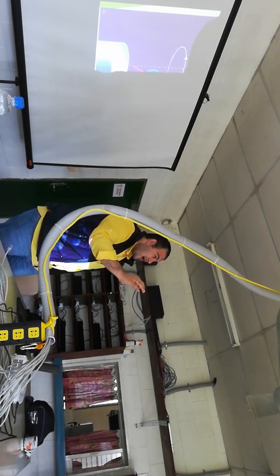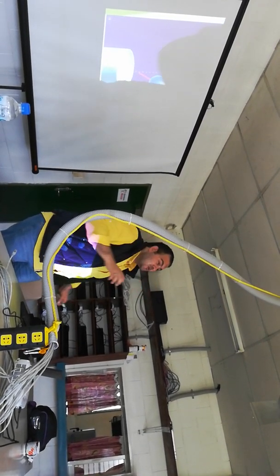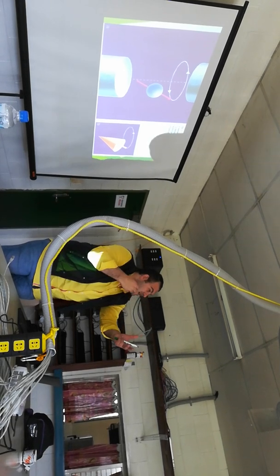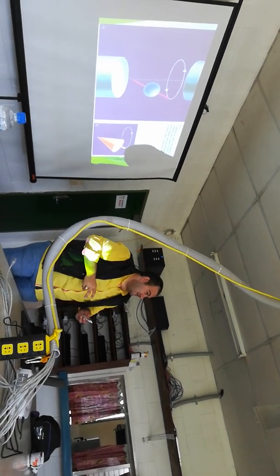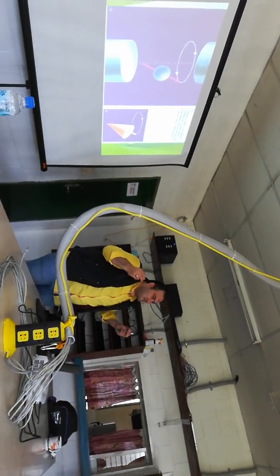After a certain time, I will switch off the source of energy, and the protons will be relaxed again. After relaxation, they will emit radio waves. I will acquire these radio waves again and convert them to an image. Yes? Now the idea becomes simple, yes?